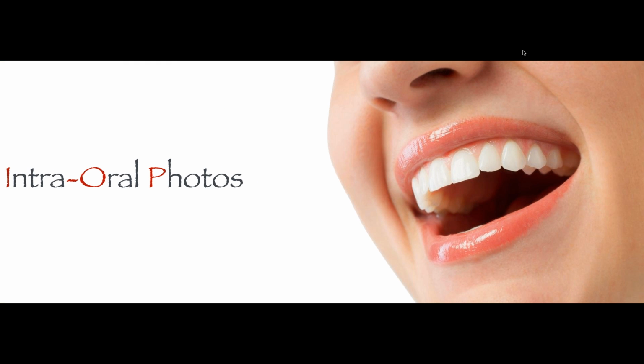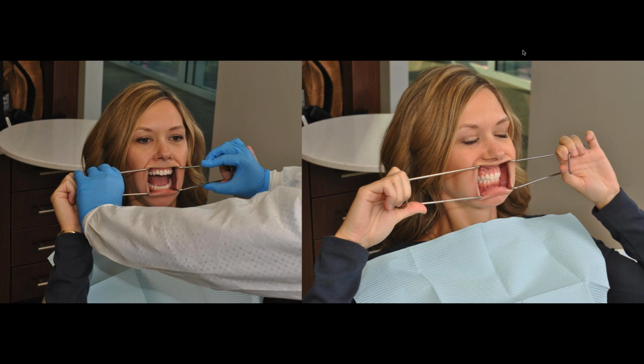Okay, now we're going to go to the intraoral photos. And this is the part that I was telling you about, where we have the patient actually help us with the intraoral photos. I am holding on to the retractors, and I'm putting them in the patient's mouth. Then I ask the patient to bite down, and I separate the retractors, and I ask my patient to hold the retractors as far away from her mouth as possible. This way, I know that I'm not hurting the patient. The patient will retract as much as she or he can without causing any pain or great discomfort. That's why I want to have my patient help me do this.